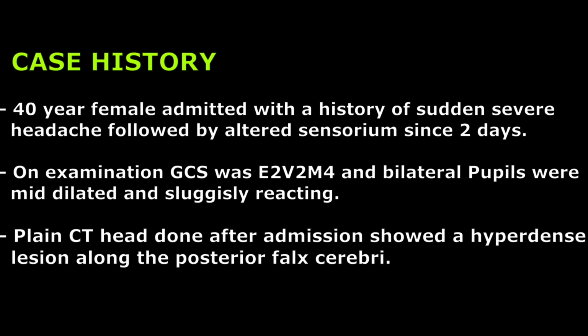A 40-year-old female was admitted with a history of sudden severe headache followed by altered sensorium since 2 days. On examination, GCS was E2, V2, M4 and bilateral pupils were mid-dilated and sluggishly reacting. Plain CT head done after admission showed a hyperdense lesion along the posterior falx cerebri.